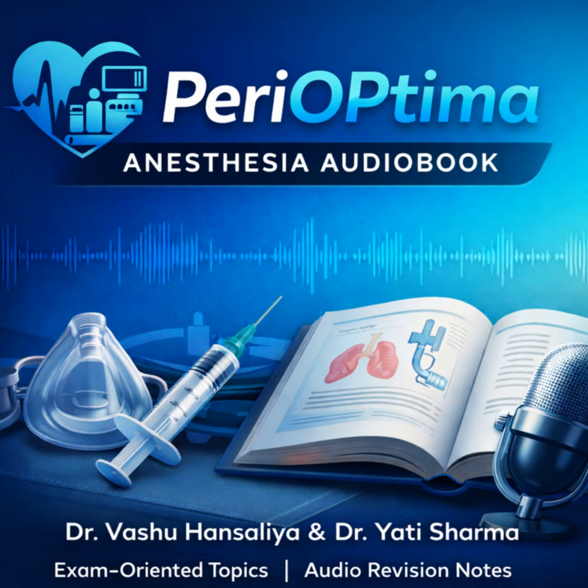Why is the oxygen flowmeter position always on the right? This is a critical safety standard. The O2 flowmeter is placed downstream of all the other flowmeters, so it's physically to the far right. And the purpose is twofold. First, it ensures that oxygen is the final gas added to the fresh gas mixture before it leaves the manifold. But second, and crucially, it safeguards the FiO2 if there's a leak.